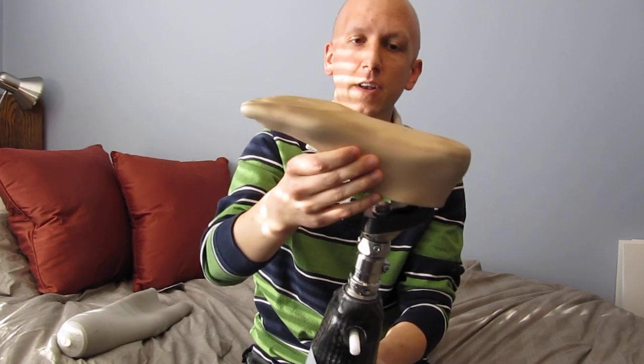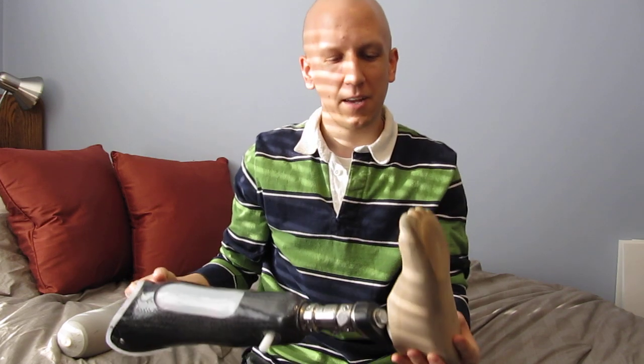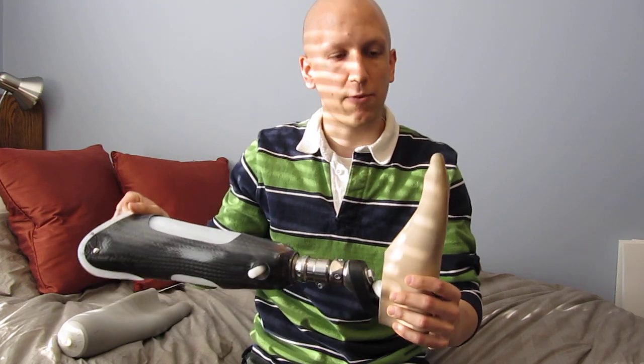Moving down, the foot is just plain plastic. It's a little bit dirty since I pulled it off of my previous leg. It's sized to be the same shoe size as my actual foot.